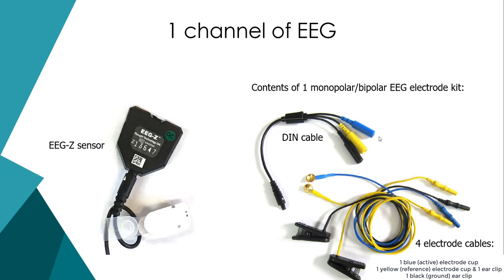The blue plug or blue cable is the active electrode that gets placed on the surface of the head where we want to measure EEG. The yellow reference electrode sometimes goes on the ear and acts as a reference where there's no brain activity, as compared to the blue active electrode where there will be brain activity. The black ground electrode almost always goes on the ear — not the same ear as the reference, usually the opposite side. You want the yellow reference to be on the earlobe closer to the blue active electrode, and the black ground on the earlobe further away.